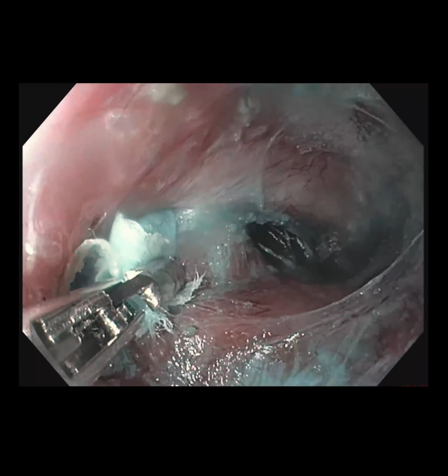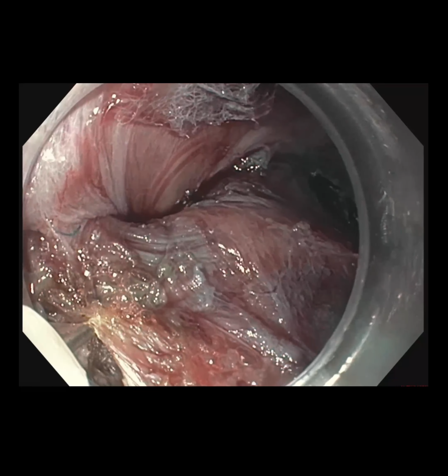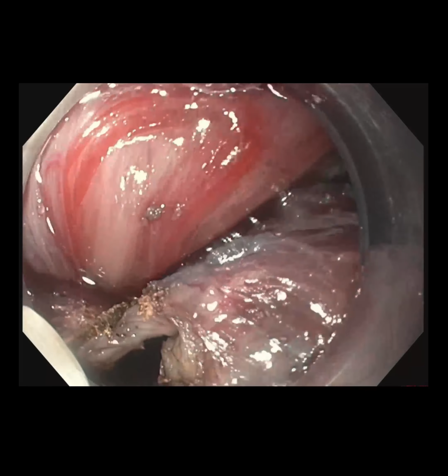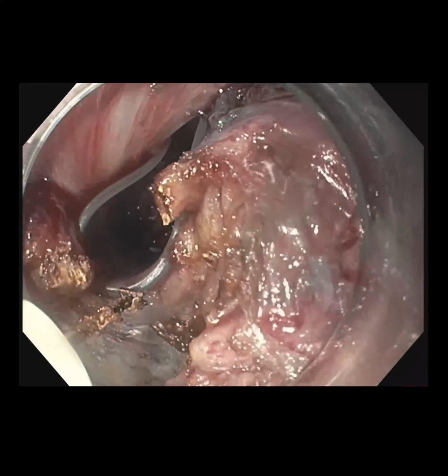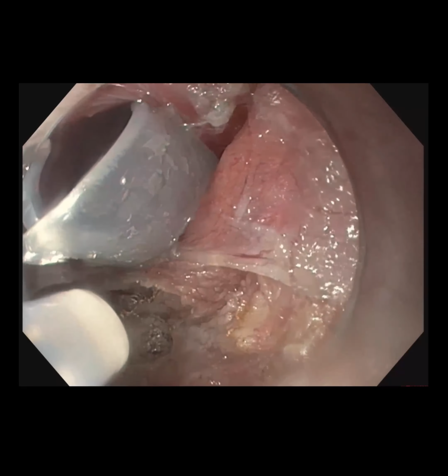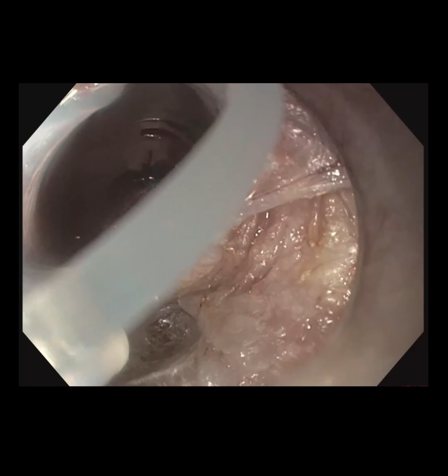Upon retracting the scope from the lower esophageal sphincter, the cap got dislodged and got firmly stuck at the level of the LES. In spite of multiple attempts to remove the cap, which failed, I finally had to do some local myotomy at the level of the cap to visualize it. Muscle fibers below the cap were also dissected gradually, and with the help of grasping forceps, the cap was pulled and removed.